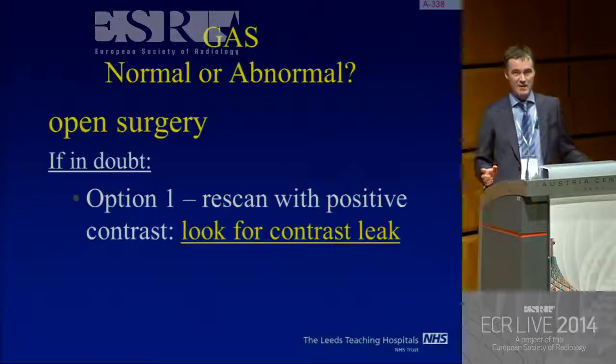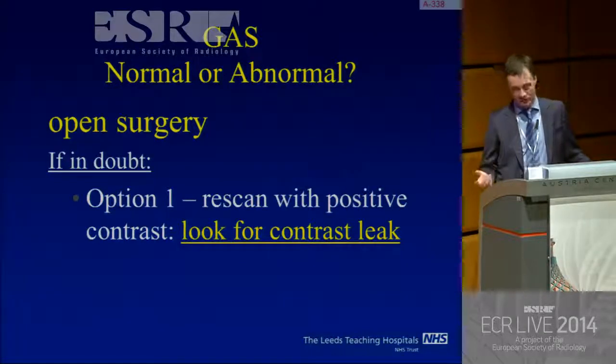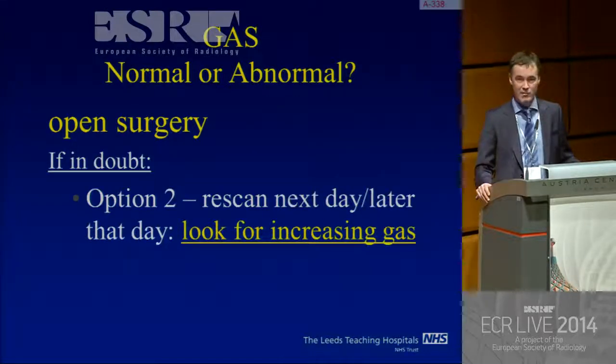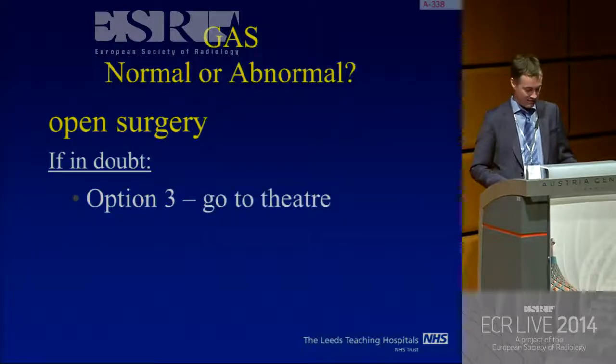Now, if we have gas and we're not sure really what's going on, and you've not given the patient positive contrast, you always have the option of give them the contrast, send them back to the ward, and get them back again later in the day to repeat the scan to look for contrast leak. Another option is to scan the patient the next day and see whether the gas is increasing, particularly if the surgeons really aren't sure what's going on and they just want to watch the patient.